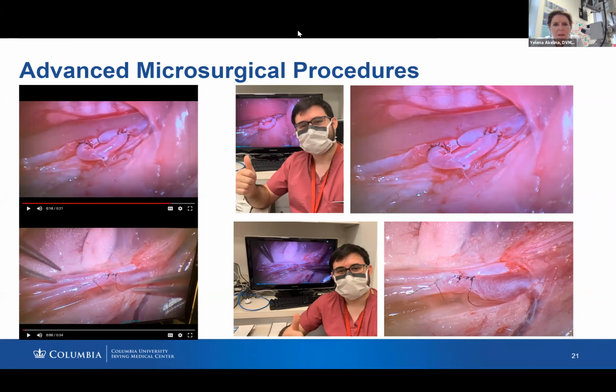How do you manage if you find out that you have sutured the back wall together with the front? We revise this. We take the stitch apart. When we open the vessel, we look for patency, and if a vessel is not patent or any stitches sit deeper in the suture line, we take them out, examine the anastomosis and just revise it.